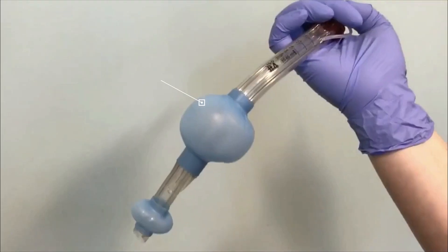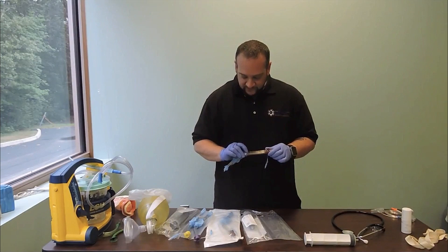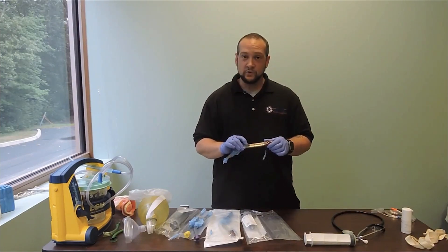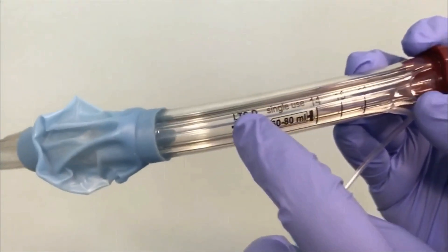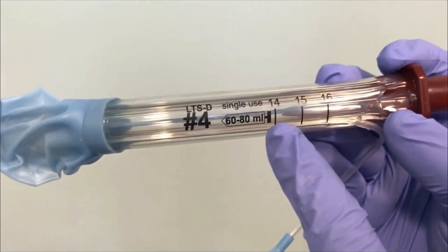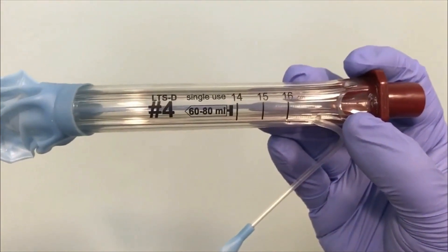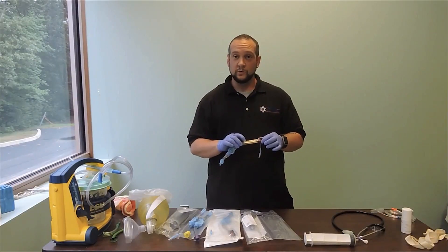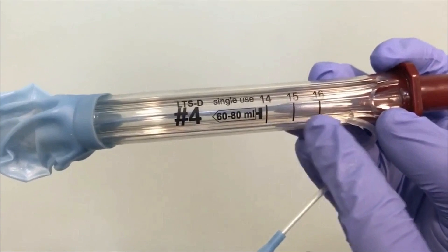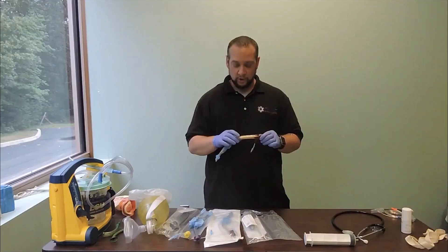Our proximal cuff, when inflated, sits in the oropharyngeal area. Here we can see the labeling: this is an LTSD, size four, which is appropriate for patients between five and six feet tall. It indicates that it's single use — all of our airway devices are disposable, used only one time. It also tells us the appropriate prescribed volume of air to achieve the correct seal on our cuff.